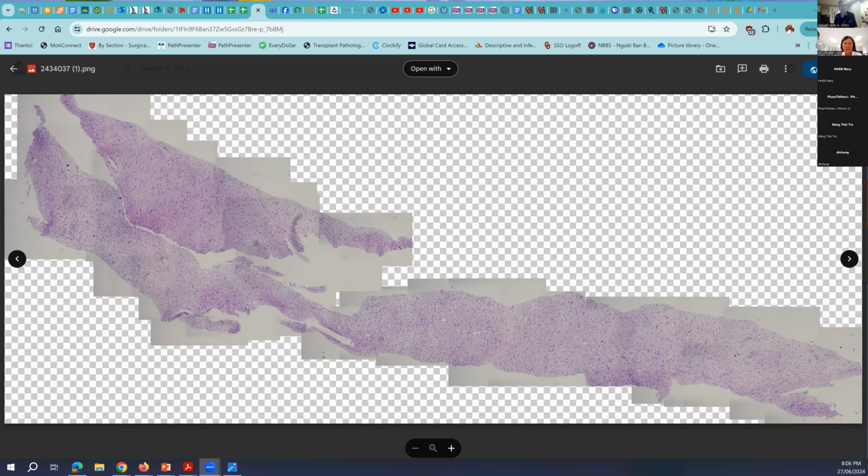I'm happy to have this opportunity, and I'm particularly grateful that Dr. Lin has shared some interesting and challenging cases for our discussion. And we will discuss those first. And then if we have more time, I have a series of cases on soft tissue tumors with an inflammatory pattern that I am beginning to prepare into a lecture, and maybe we can look at some of those slides too. So we'll begin with this slide here on your screen.